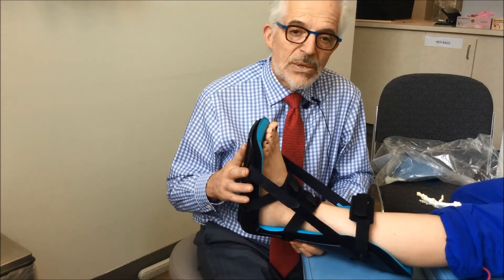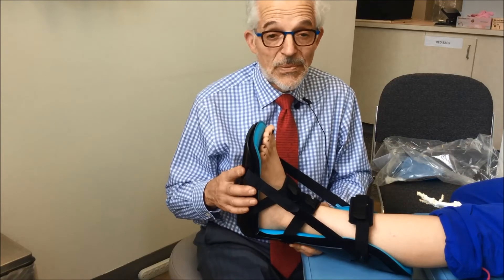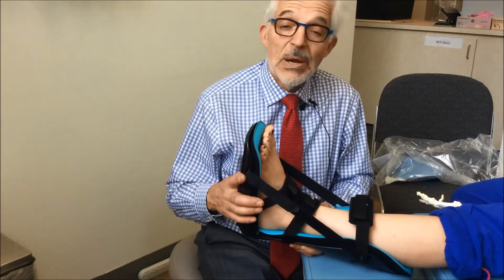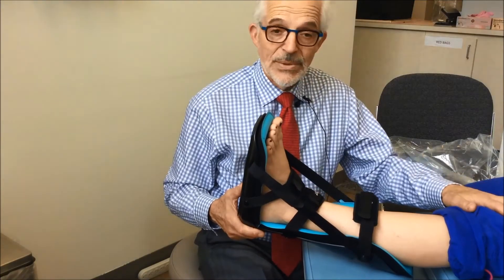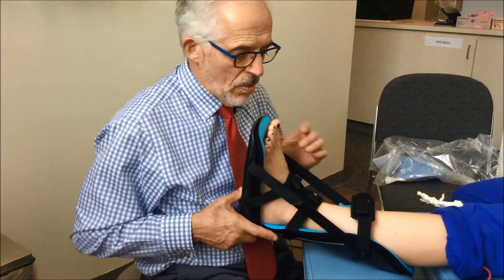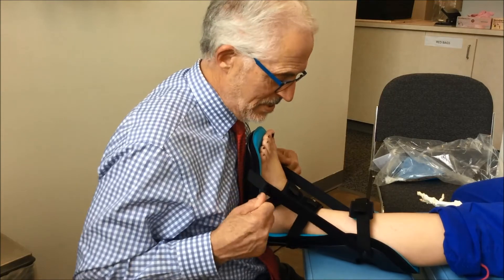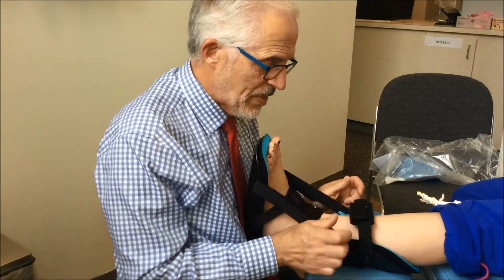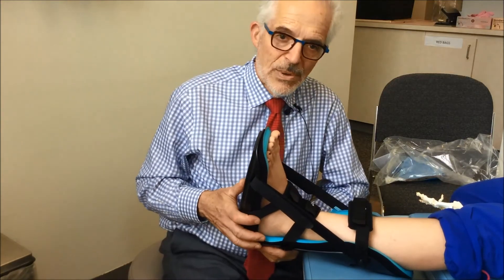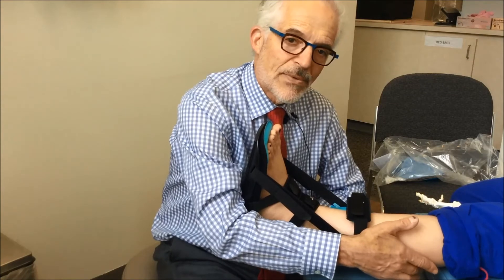30 minutes of standing against the wall sounds like a lot, but 30 minutes of sitting before your television, watching your favorite program is pretty easy to do, with your foot on a coffee table and the knee straight. You don't need to tighten this a lot. The goal is not to cause pain to get the result. The goal is to allow for stretching with no discomfort and minimal tension, which you would feel up at the top of the calf.